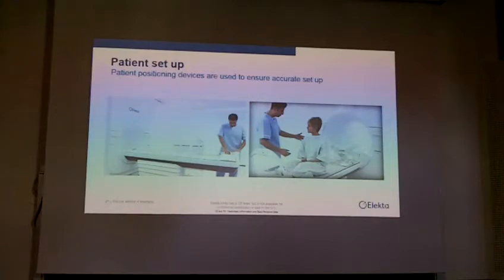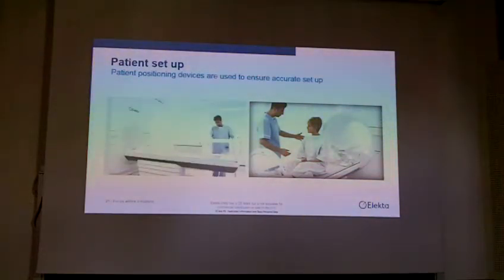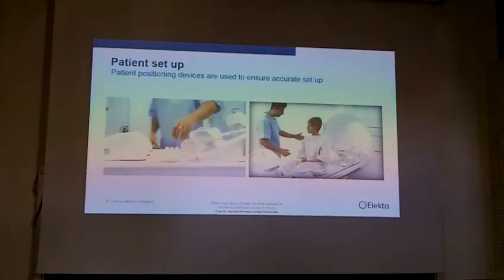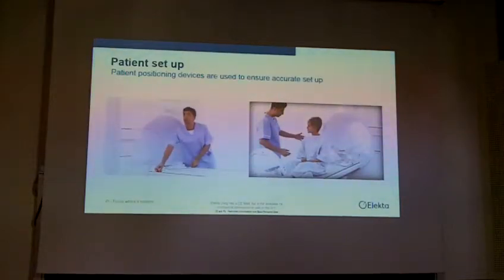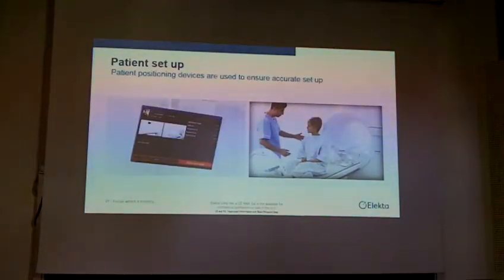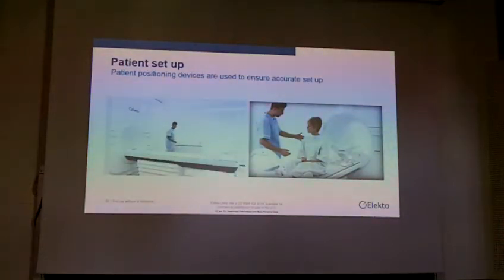I don't know if you see it. Elekta Unity opens also new treatment paradigms, starting with the patient positioning. There are no lasers needed anymore.